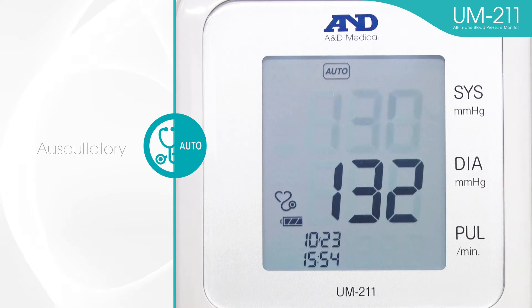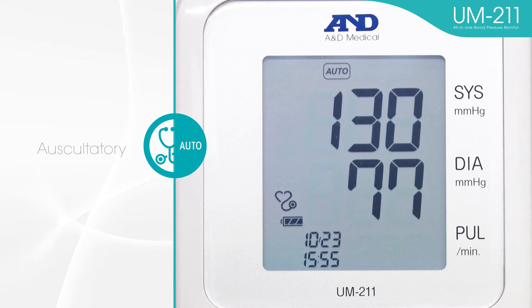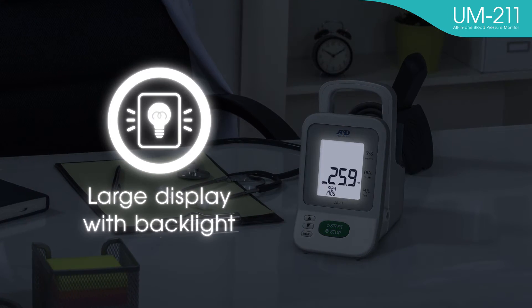The UM-211's auscultatory mode is designed for daily and frequent use. You can mark specific values like systolic and diastolic blood pressure. Other useful features include a rechargeable battery, large display with backlight, and room temperature display.